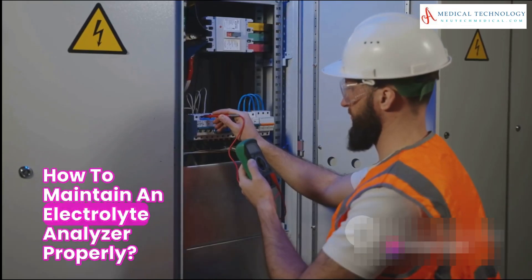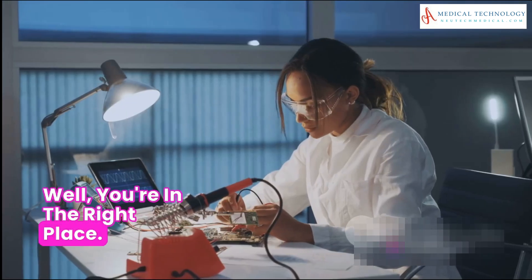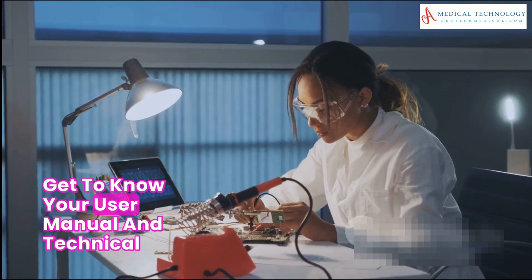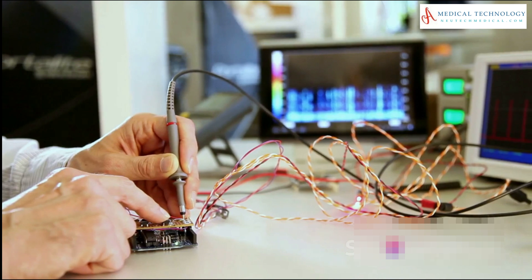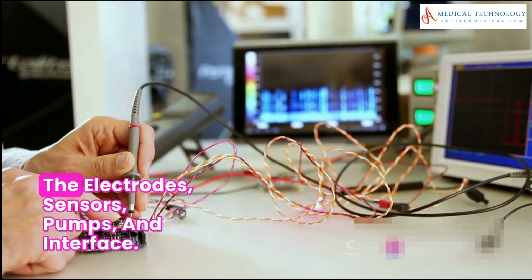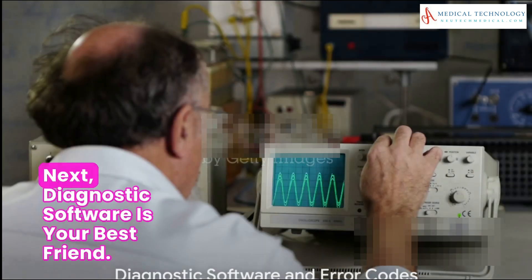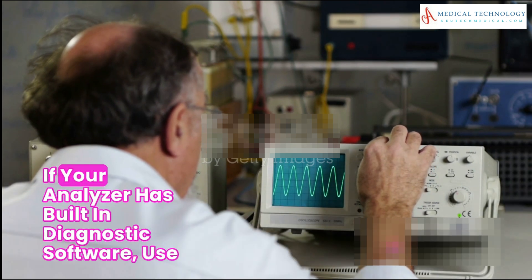How to maintain an electrolyte analyzer properly — well, you're in the right place. First, understand the basics: get to know your user manual and technical documentation like the back of your hand. It's important to identify the key components of the analyzer, including the electrodes, sensors, pumps, and interface.